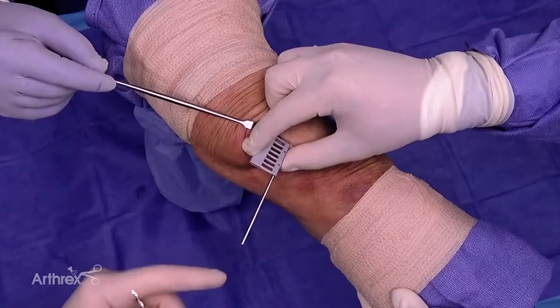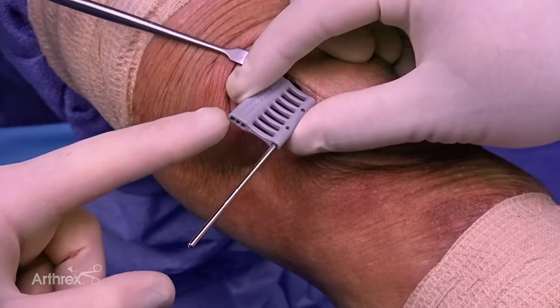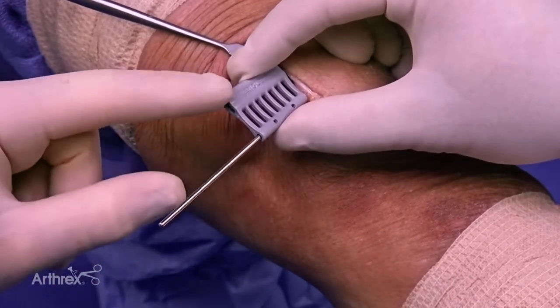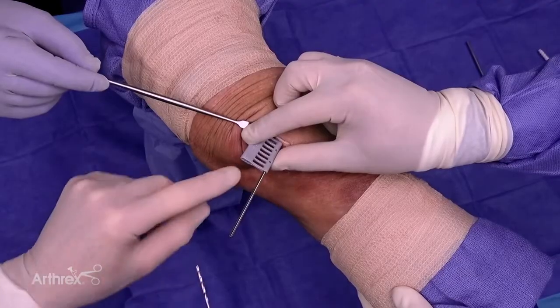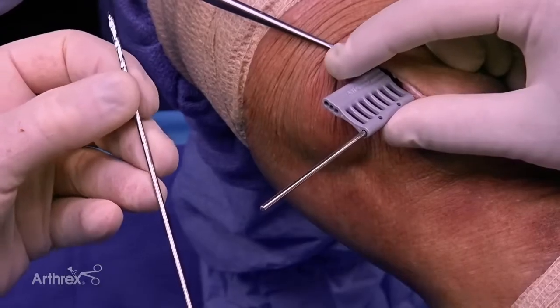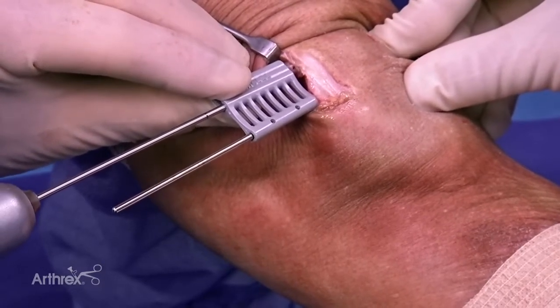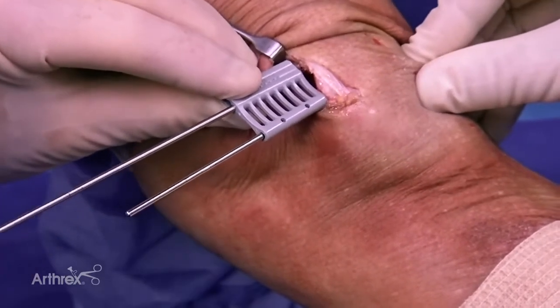We put the shorter pin at the equator. With this guide I have the option of 15 millimeters difference, 17.5, or 20. I usually take the 15. We set this one to be a little convergent — remember there are two options, a parallel guide or the angle guide which can be either convergent or divergent. For this small patella we chose to make it a bit convergent. I go to the 15-millimeter mark. It's important to chuck the longer pin at this laser mark before you drill so you won't hit the other pin. I drill to the depth of that laser line.